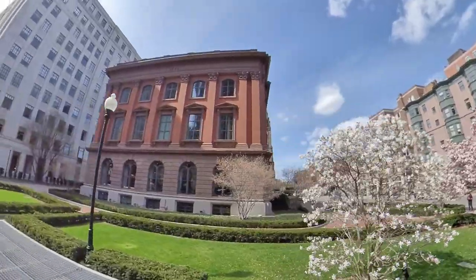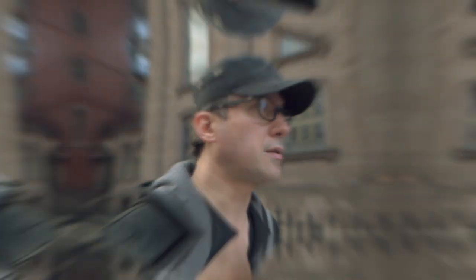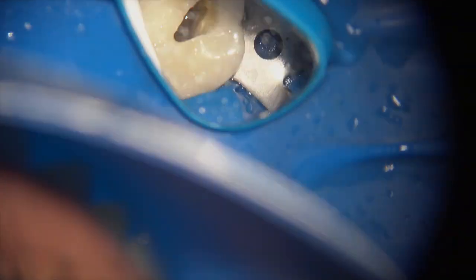We got started and the patient was anesthetized with the PSA block and some buccal infiltration. There was a little bit of swelling but a tremendous amount of pain. We got started on access through the tooth, through the crown, with the shield on.